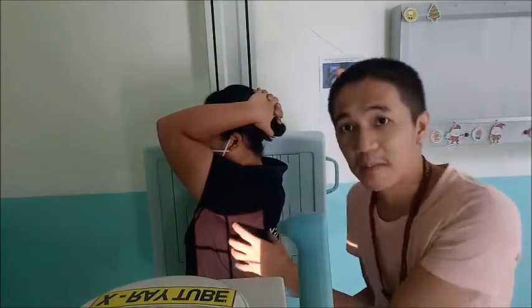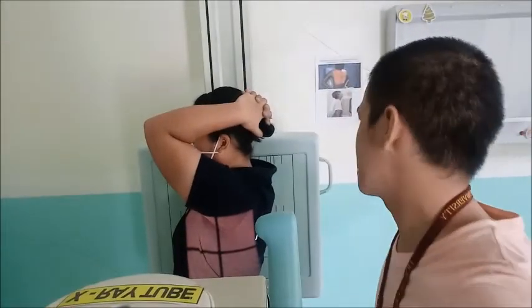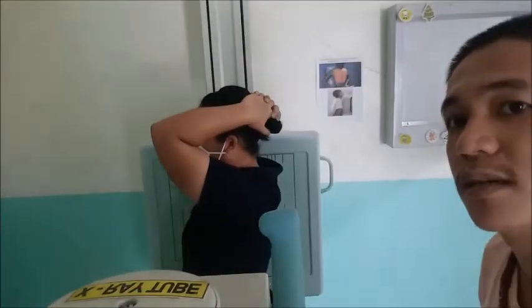So kung makita ninyo murag gamay ra nga area ang naigo ng patient. Pero actually maigo na tanan. So as you can see, ang top portion sa cassette is already at the shoulder ni patient. Kung ipaubos niya ang iyang kamot, siguro makita na ang apex niya. Since nakasaka man ang both hands, naka-place na siya superiorly, but the lungs are not pulled superior. Mag-remain yung lungs sa ilang place.